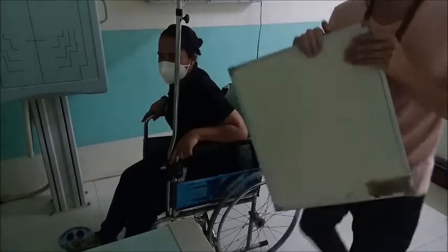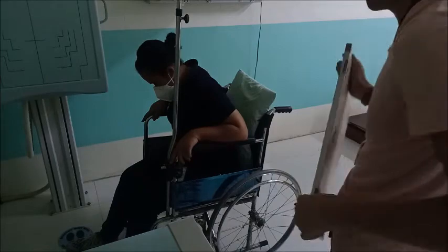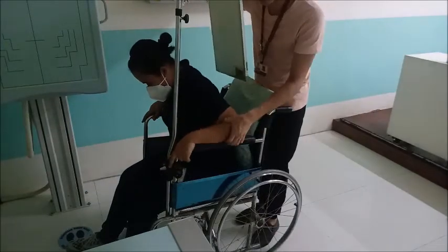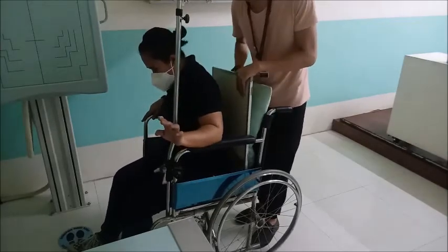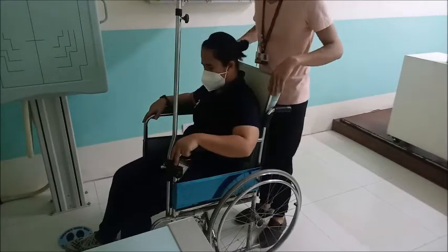Pwede matagak ang cassette. And then, of course, following the rules in inserting the cassette, the marker side of the cassette should always be on the right side of the patient. Right side of the patient. Right side sa cassette. Again, right side. Tuwa sa ubos yung marker. Which is still correct.